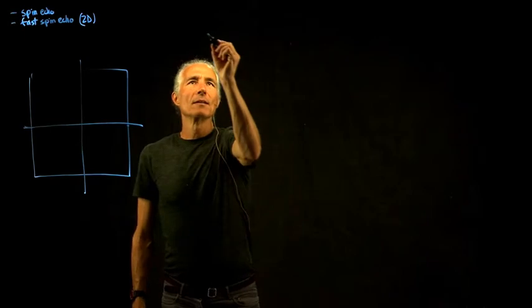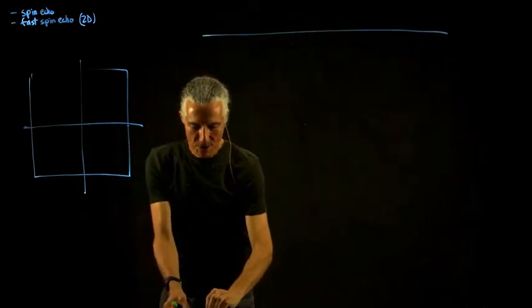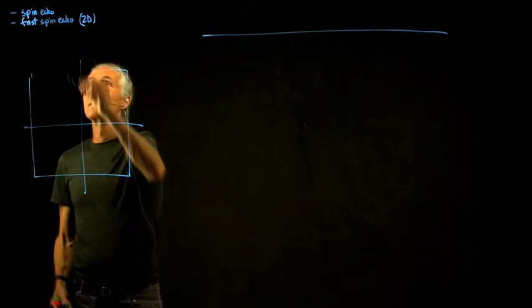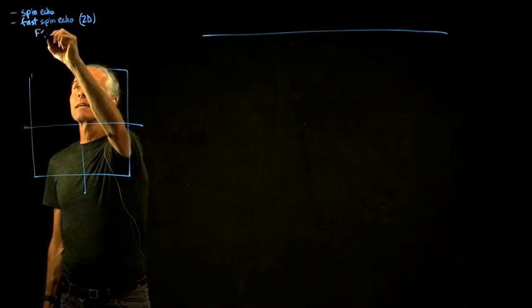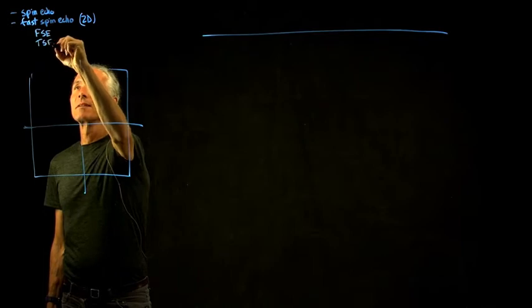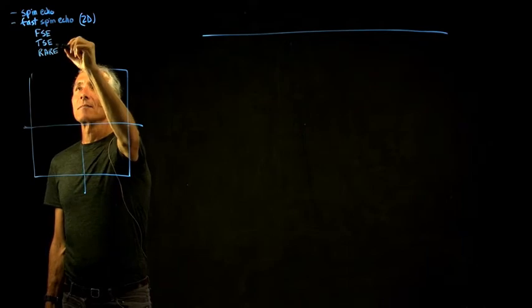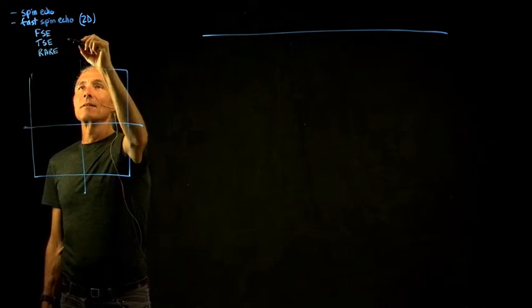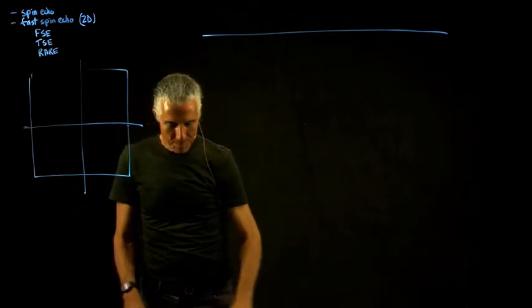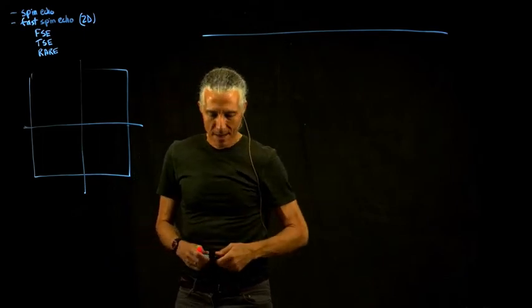So if we draw this sequence out, so this one's called turbo SpinEcho. Sometimes it's called fast SpinEcho, or sometimes it's called turbo SpinEcho, or sometimes it's called RARE. I can't remember what that means, but probably turbo SpinEcho is the one that's most commonly used. And so the idea is we want to collect multiple lines of K-space just from one 90.